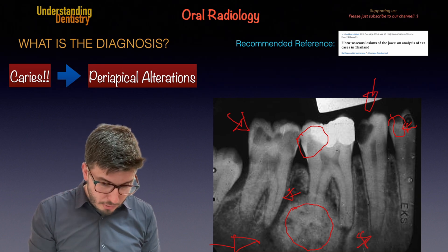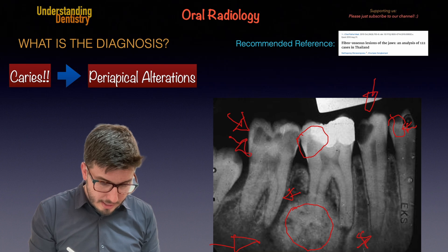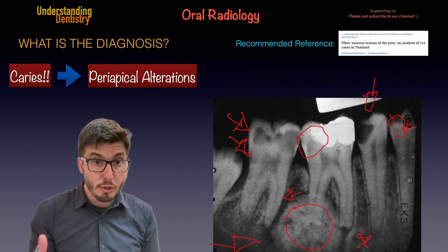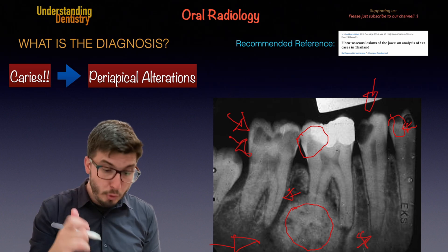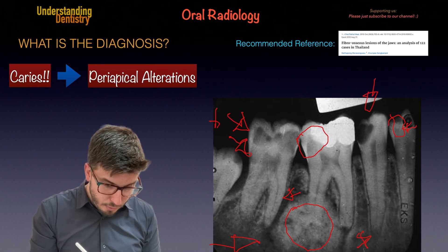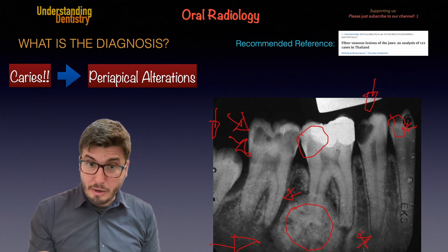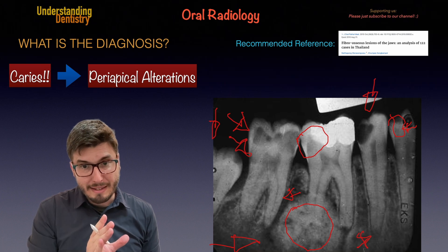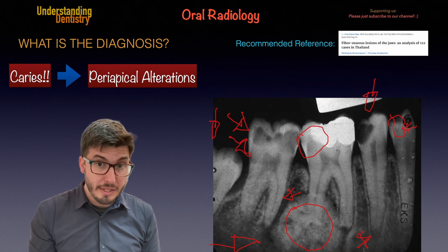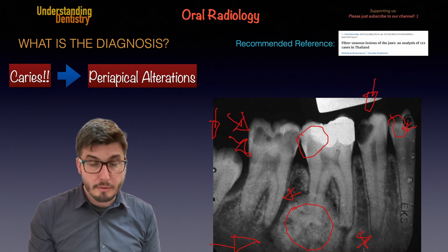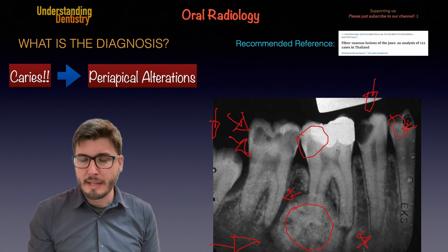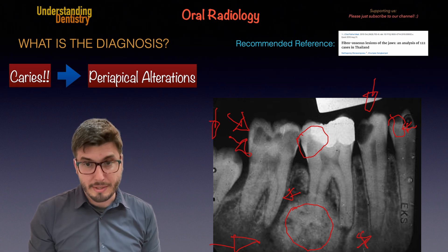Even interproximal distal caries here — related to the fact that the third molar is vertically impacted. The third molar also has occlusal caries, and the third molar is in contact with the CEJ of the second molar. Probably this was very close and there was food packing, and this was most likely the cause of this distal caries.